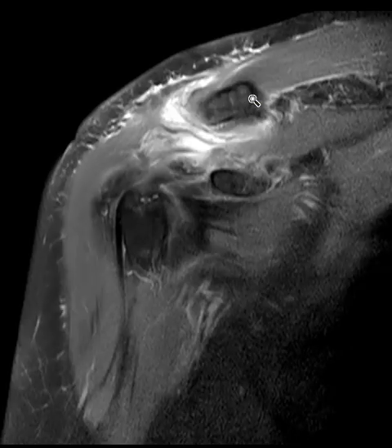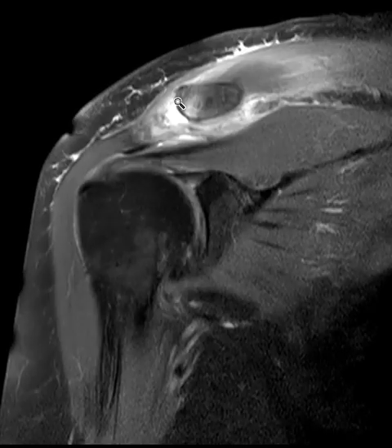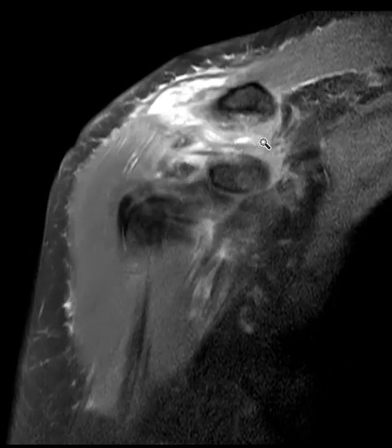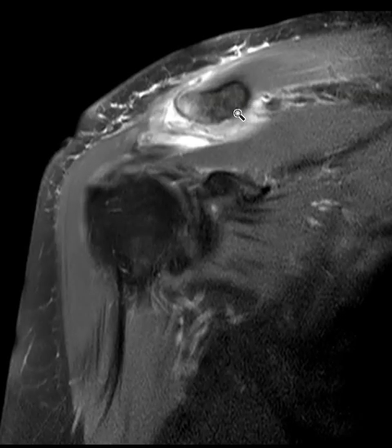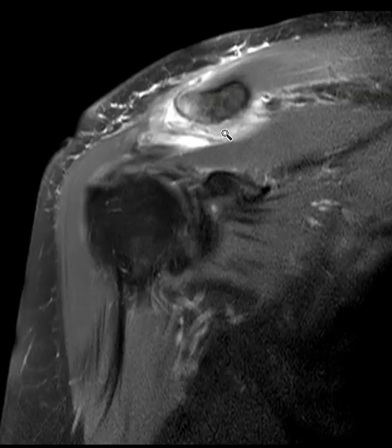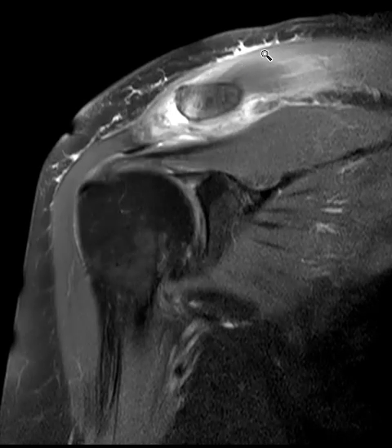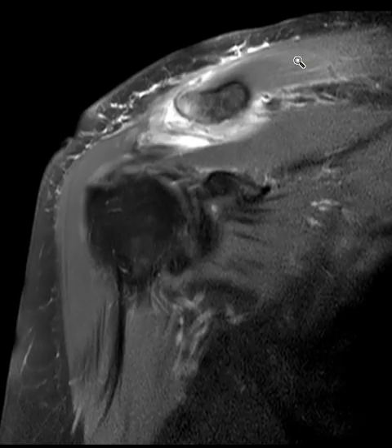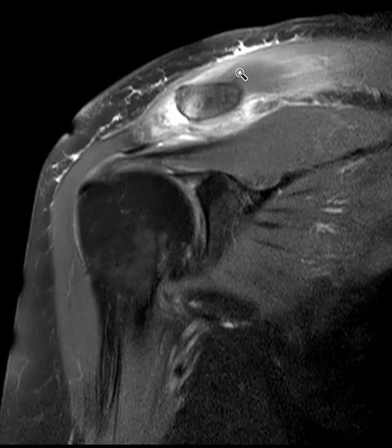The clavicle has drifted superiorly because this ligament complex is torn. When we have a complete tear of the AC ligaments and a complete tear of the coraco-clavicular ligaments, we call this a grade 3 AC separation. The clavicle is just drifting superiorly with nothing holding it down, so this is one that will need surgery. In this patient, we see some brightness in the trapezius muscle — the muscle is partially strained, which is a common finding with a severe AC separation.